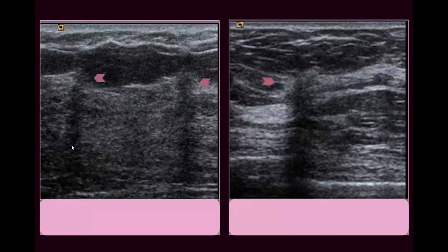There is shadowing here, and we can see some angulation here. So we expect this to be from Cooper ligament, but we need to make sure that this is due to Cooper ligament. But when I look here, there is a subtle distortion associated with this shadowing.